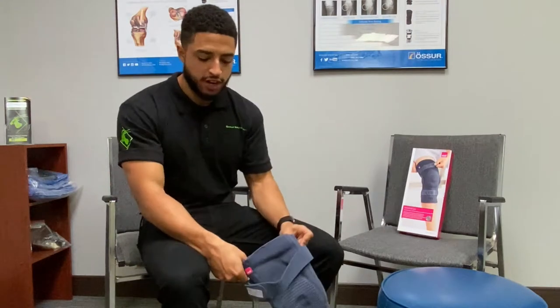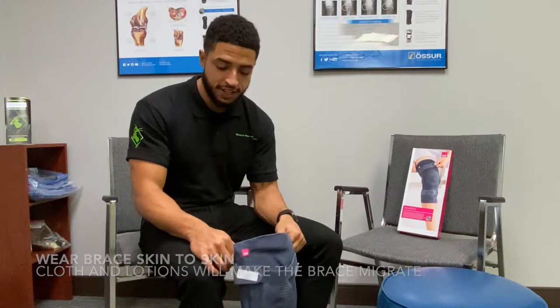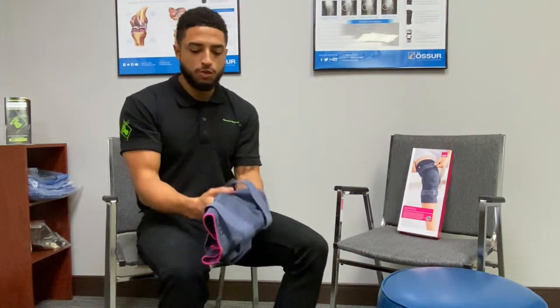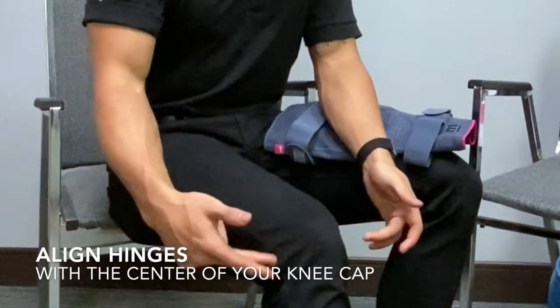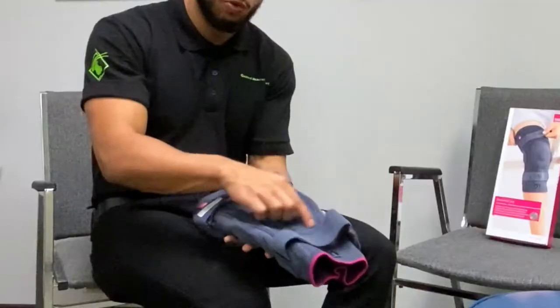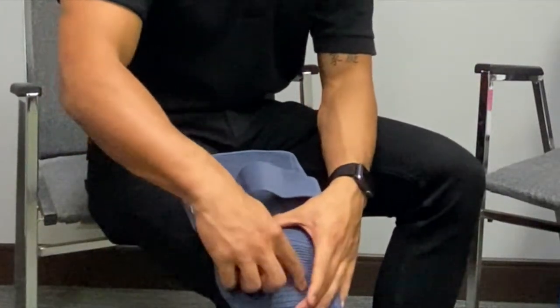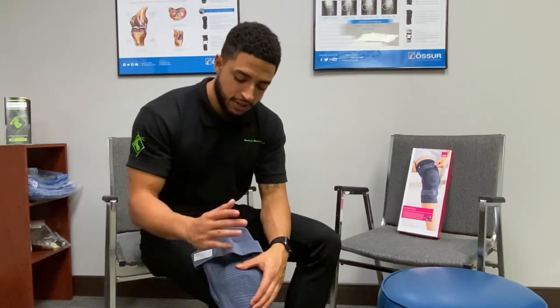When putting the brace on, it is recommended you do not put it on top of your clothes — put it on skin to skin. The reason being, there's this silicone ring here; these beads keep the brace from sliding. What you want to do is align the two hinges on the medial and lateral side of the knee. They make that really easy with this ring here — when you pull the brace on, the ring has a center for your kneecap. As long as your kneecap is in the center of the ring, you're good to go.